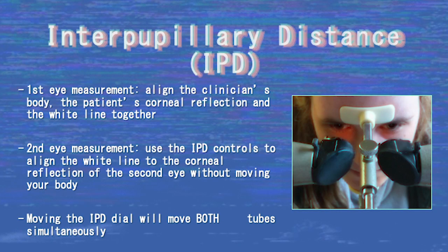For the first eye measurement, align the clinician's body, the patient's corneal reflection, and the white line together. When aligning the second eye, use the IPD controls to align the white line to the corneal reflection of the patient's second eye without moving your body, as this will affect the IPD measurement. Importantly, moving the IPD dial on either side of the machine causes both the left and right tubes to move simultaneously.